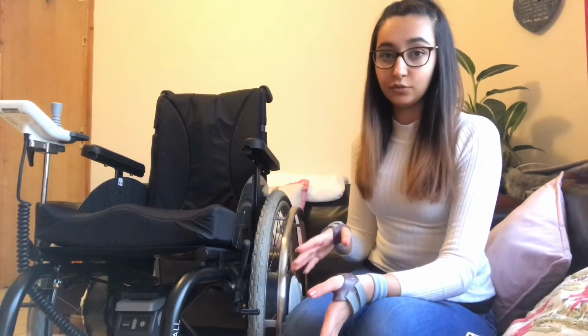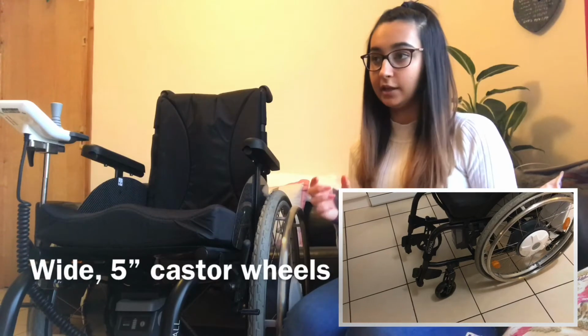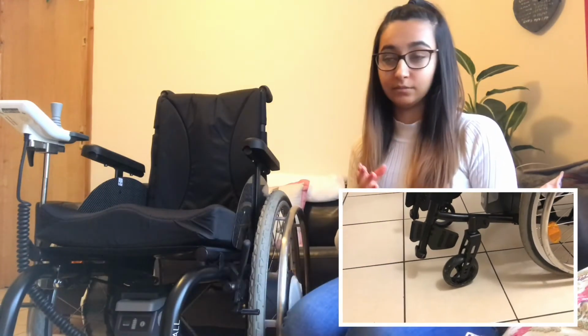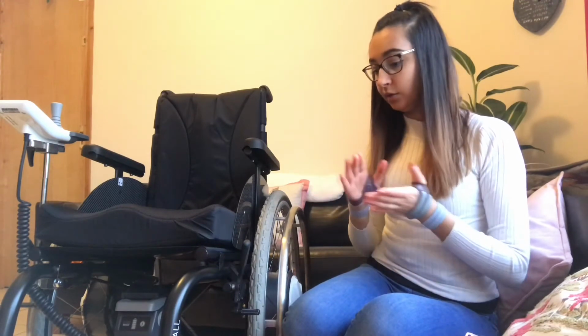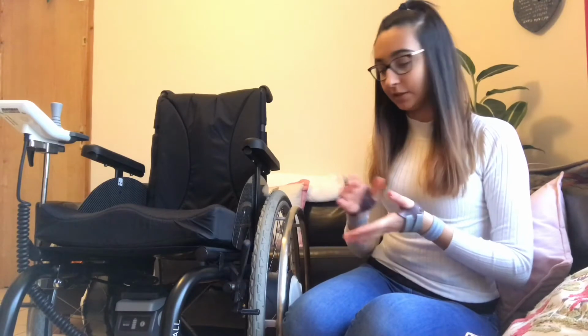I'll insert a photo of that as well. I got a size up on the caster wheels, and they're also a thicker wheel, and that just helps you go up more surfaces, because in this wheelchair you can't just do a wheelie to get over bumps. You are more so relying on the chair to get you over those little curves and things like that.